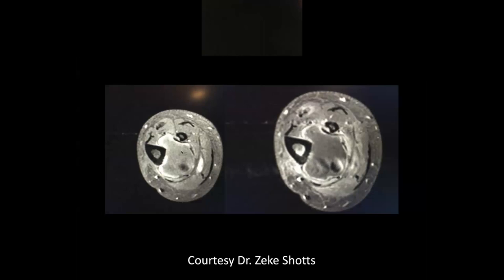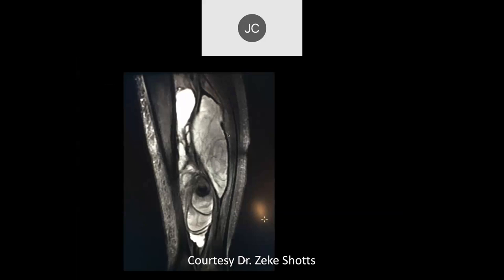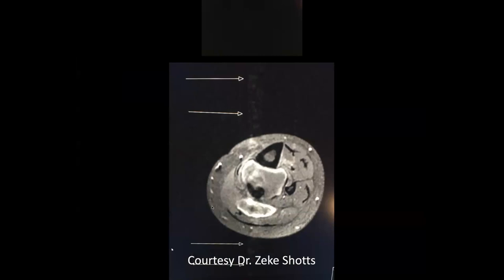This is post contrast. It's almost like an abscess inside. Yeah, see, I don't think these are contrast. I think this is basically a T1 and a PD fat sat. Okay. And then here we can see on the sagittal images. So they're worried about ruling out infections. It's like fluid collections. Or okay, all right.